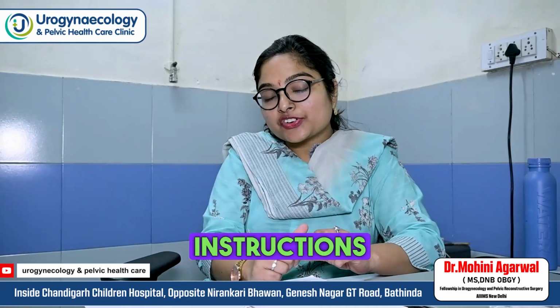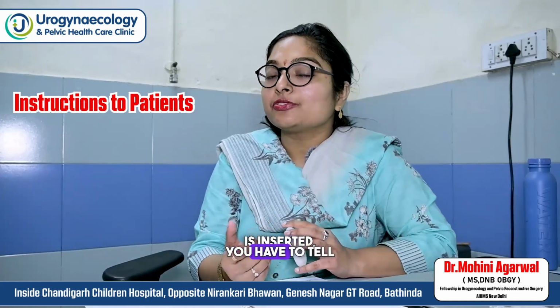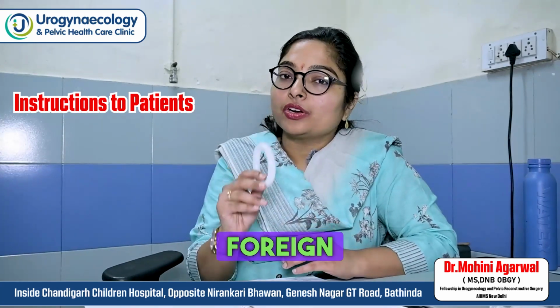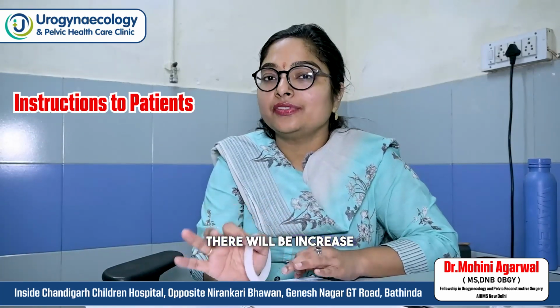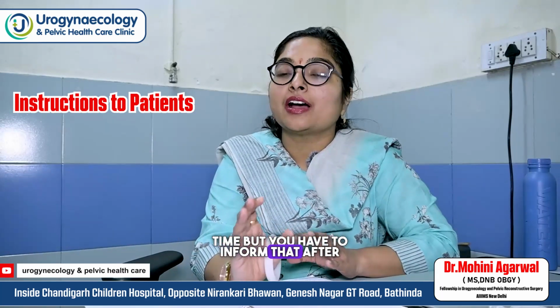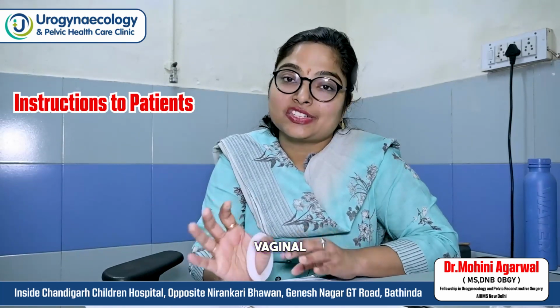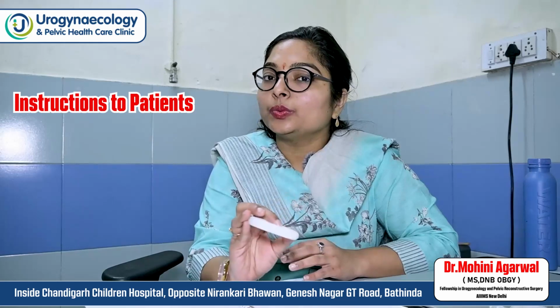Now what instructions you give to the patients? Once the pessary is inserted, you have to tell some patient instructions. One thing is that pessary is a foreign body, so there will be a reaction to it in vagina. So there will be increase of discharge, will be settled over a period of time, but you have to inform that after insertion of pessary, there might be increase in vaginal discharge. Otherwise, patient may get fearful.